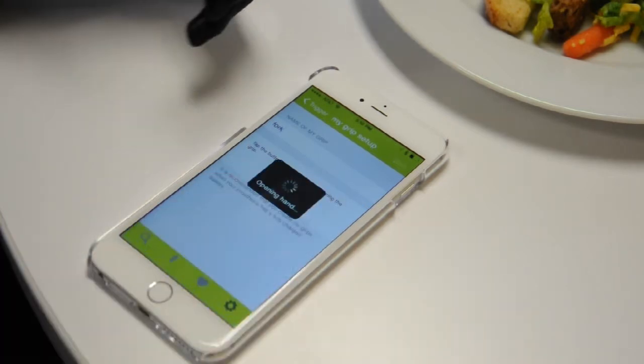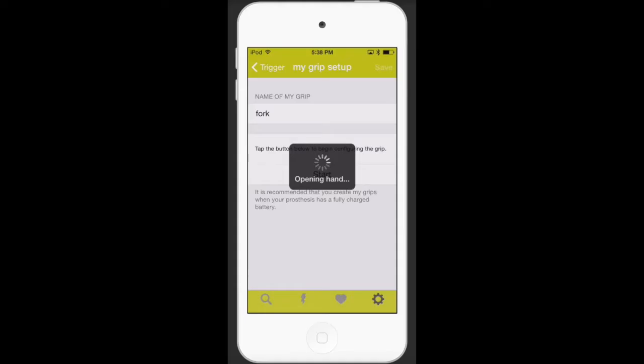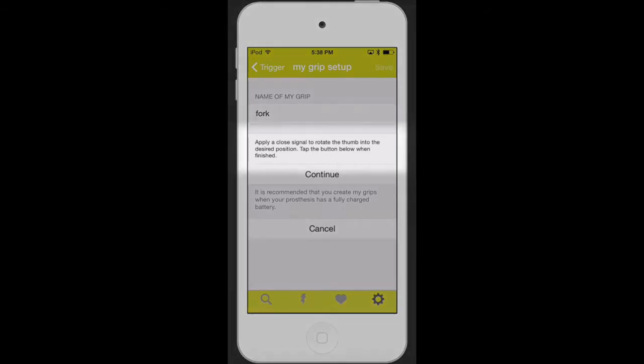The hand will immediately open all fingers and move the thumb to a lateral position. The first step in the learning process is to provide a closed signal to rotate the thumb to the correct position. If the thumb should remain in the lateral position during the MyGrip, like it will in this example, simply press Continue.